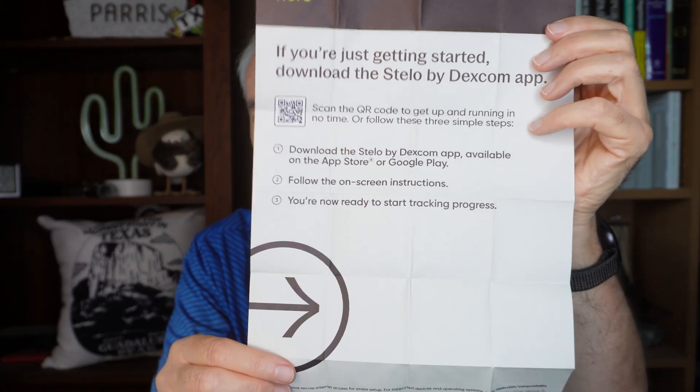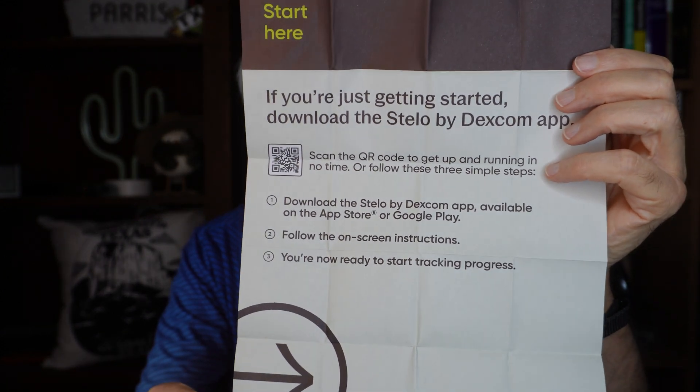It says start here, and I think you can do just about all of this with the app. I watched the videos — they have a series of videos that walks you through this. The large included piece of paper says: go get the app, it'll tell you what to do. The other piece unfolds into a gigantic thing with warnings and precautions, so you can't say they never told you. Also, they don't actually call this a continuous glucose monitor — the FDA has specific requirements for that. They call this a glucose biosensor.